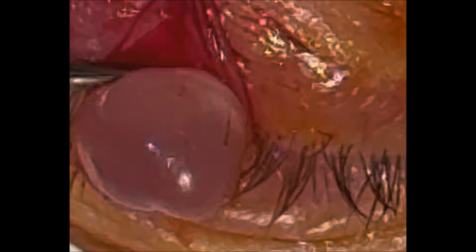And it's very important, again, to get this entire cyst wall out. Otherwise, the cyst can recur. So again, in a lot of cases, the cyst wall punctures prematurely, and then you just kind of have to remove the fragments, and you have this deflated cyst. Most of the time, it turns out fine, but you always are concerned about any remnants of that cyst.